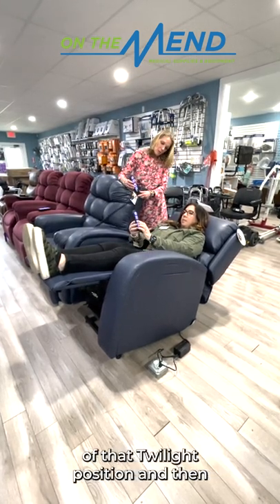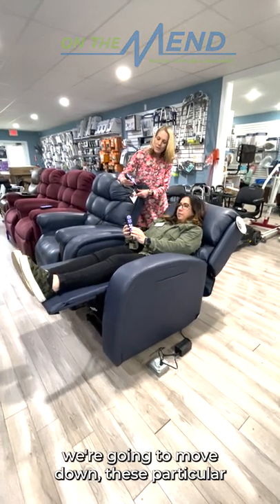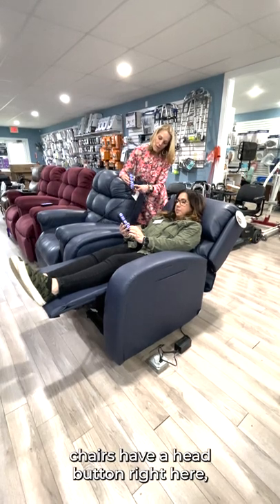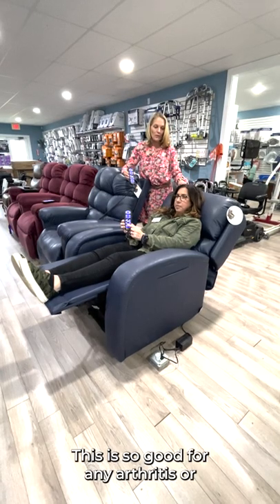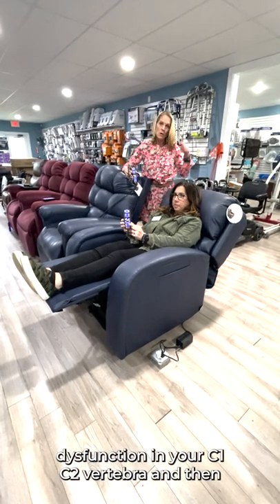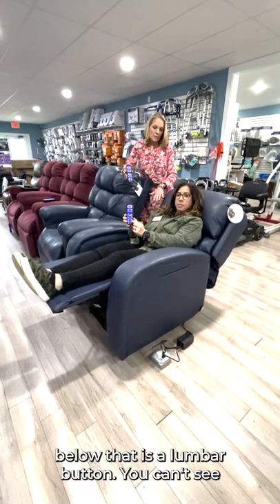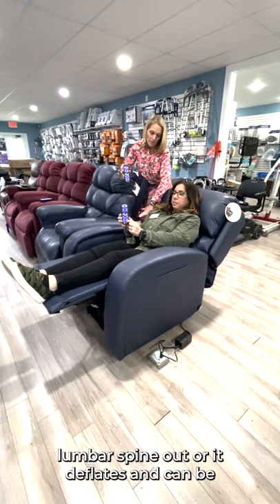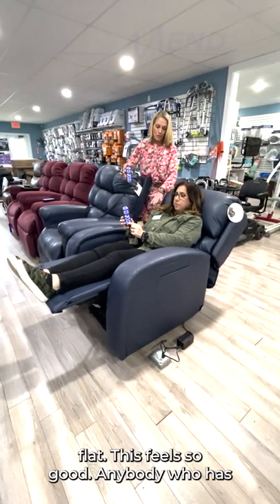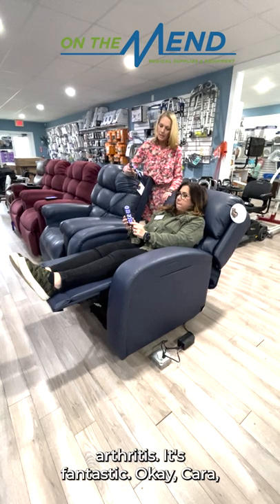So why don't you come out of that twilight position? These particular chairs have a head button right here, which would raise only the head up and back. This is so good for any arthritis or dysfunction in your C1, C2 vertebra. And then below that is a lumbar button. You can't see what this is doing, but it's pushing her lumbar spine out, or it deflates and can be flat. This feels so good for anybody who has any low back dysfunction or arthritis.